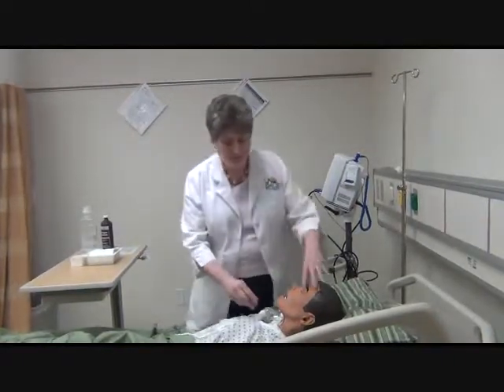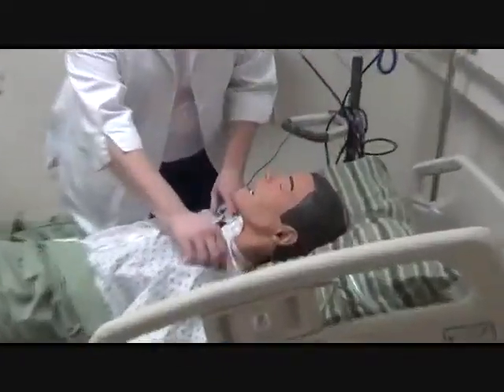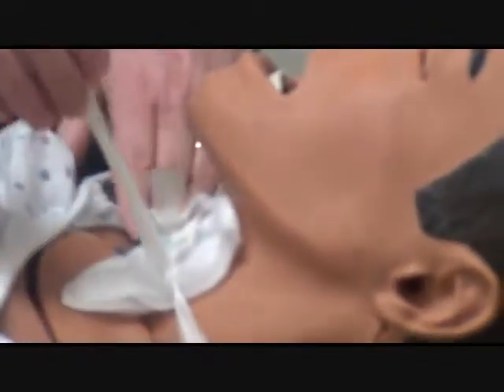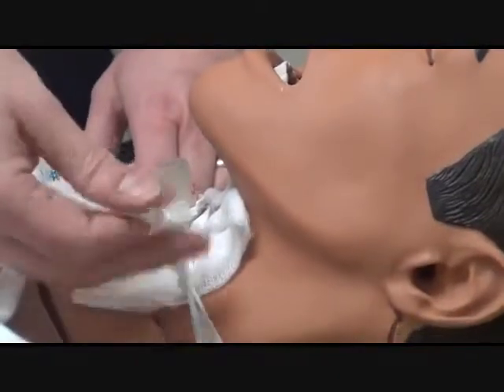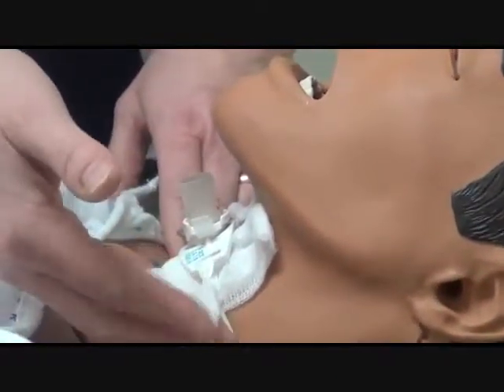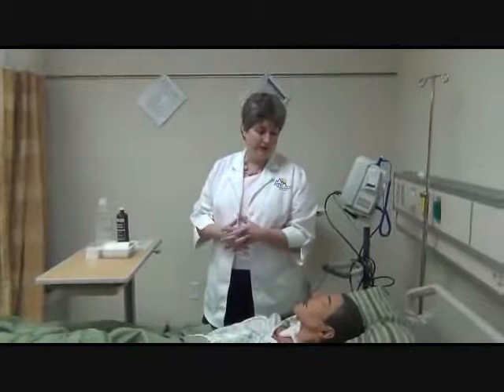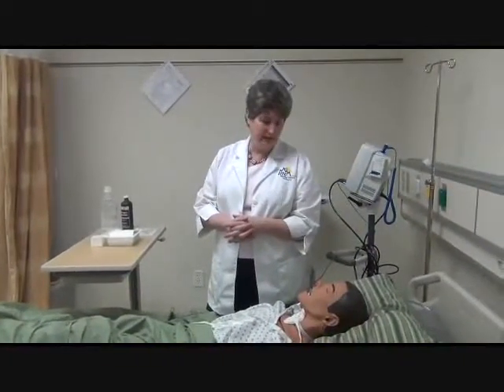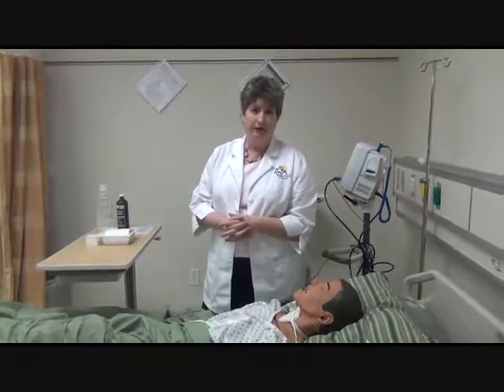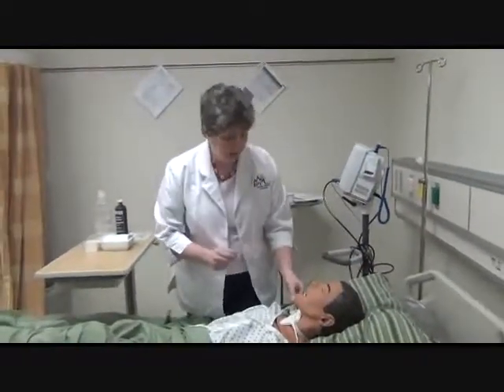Okay? There's a lot of different ties that can be used on the trachs. This particular patient has the cotton tie that comes in the kits. You're not going to see these used much clinically. You'll probably see these used more in the homes during home care. Again, any additional equipment we use is an additional expense. So there are some Velcro ties, and those are really nice because they don't put pressure on the skin. You have less breakdown. The Velcro is easy to get on and off, so it makes it nice.